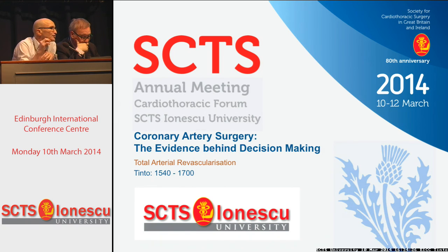I routinely use shunts, but you have to be careful how you use shunts, because, as you know, if you oversize a shunt, they can often be difficult to get back out of the coronary artery, and then you're worried that you've damaged the endothelium of the native coronary artery. But does the use of a shunt reduce the risk of you making a technical error? Yes, I think it does. Once you have used the shunt, you're happy about your anastomosis. I think it reduces the chances of you getting technical errors.